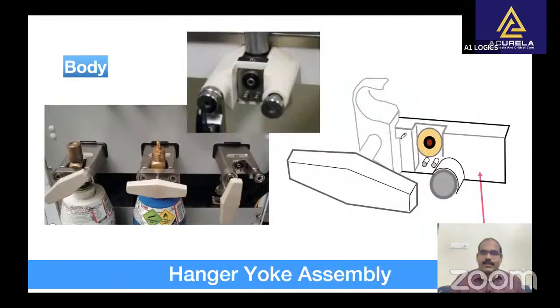The body of the yoke is threaded into the frame of the machine. It provides support for the cylinders. In the swinging gate, toggle gate or swivel gate type yoke, the distal part is hinged. When a cylinder is being mounted onto or removed from a yoke, the hinged part can be swung to the side.